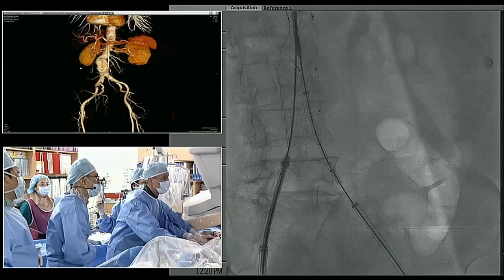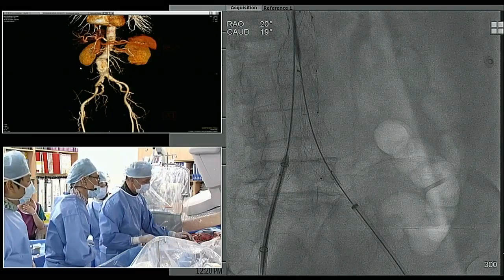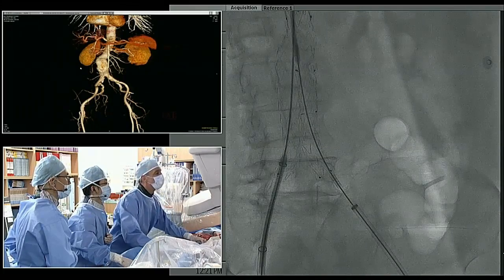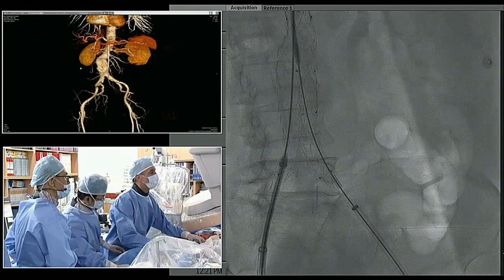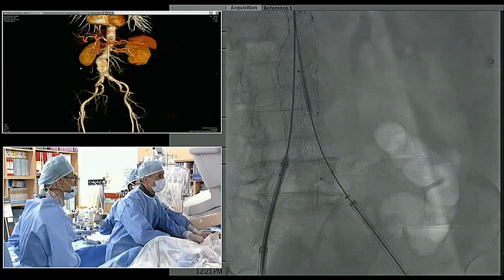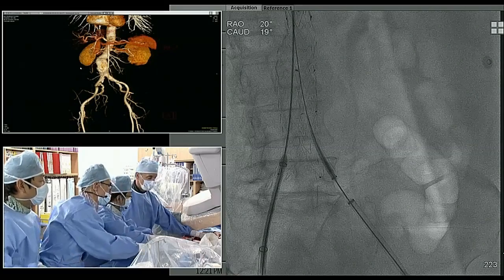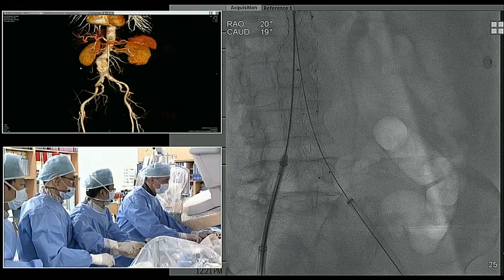And this is a nice device because I can do that with it. A little bit. So if anything, you might be just a trace high. That's fine, though. Looks like you have adequate coverage. It's not too bad. I think we do. So I'm going to pull this back in. Okay, we'll take that out now. Let's just leave that in there like that so it doesn't leak.